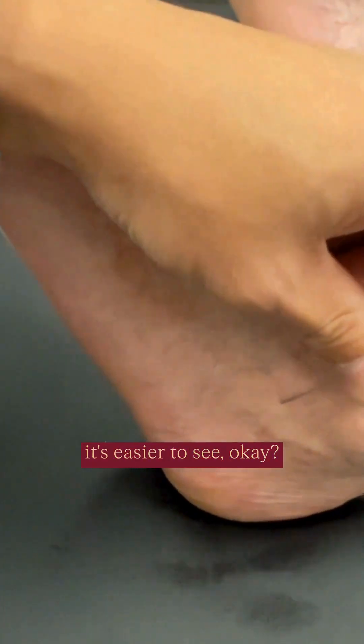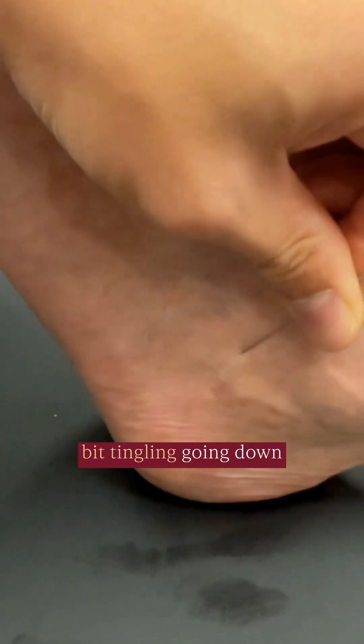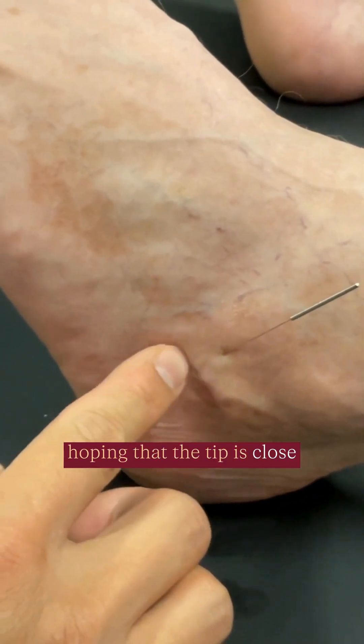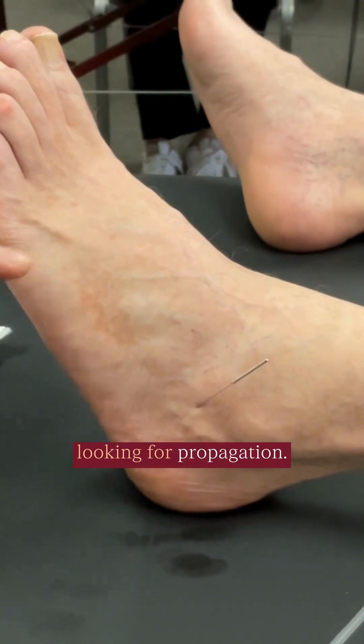Look at the sensor — it's easier to see. As I approach the nerve, he feels a little bit of tingling going down towards the toe. That's fine. So I'm about at least a centimeter in. I'm hoping that the tip is close enough to the nerve now, and I'm going to retest. Let me know if anything is too strong locally, but I'm looking for propagation.